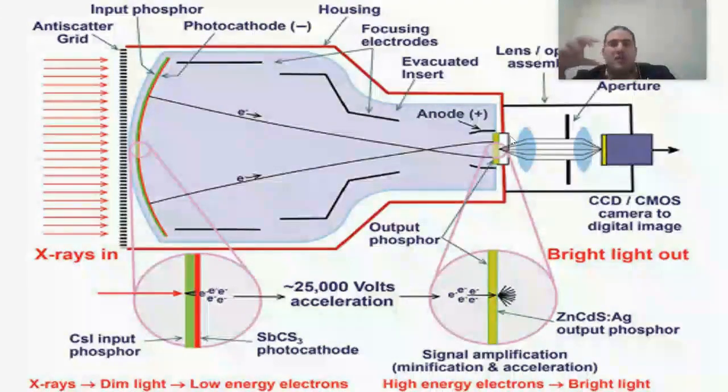The image intensifier has problems. What are the problems it faces? Why do they occur? I currently have my field of view or my input phosphor large like this, right? And my output phosphor is small. So, isn't it possible for a light photon to experience scattering?